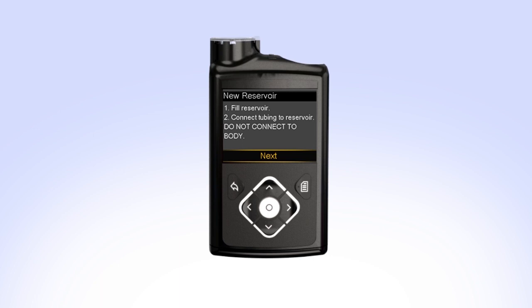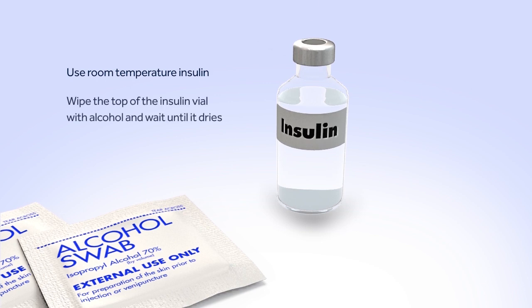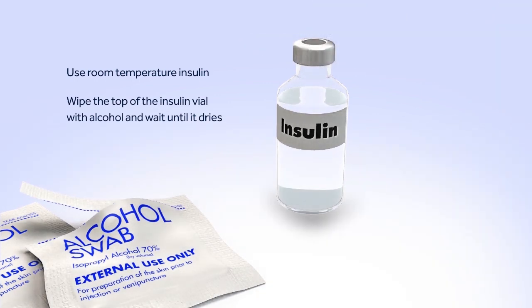You can now set the pump down and prepare to fill the reservoir. Before you can begin filling the reservoir, you will need to clean the top of the insulin vial. To reduce the risk of air bubbles, make sure the insulin vial is at room temperature. When you're ready, wipe the top of the insulin vial with alcohol and wait until it dries.